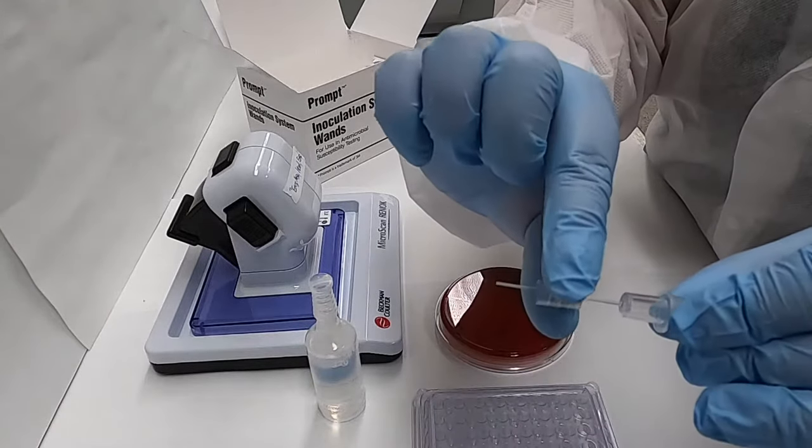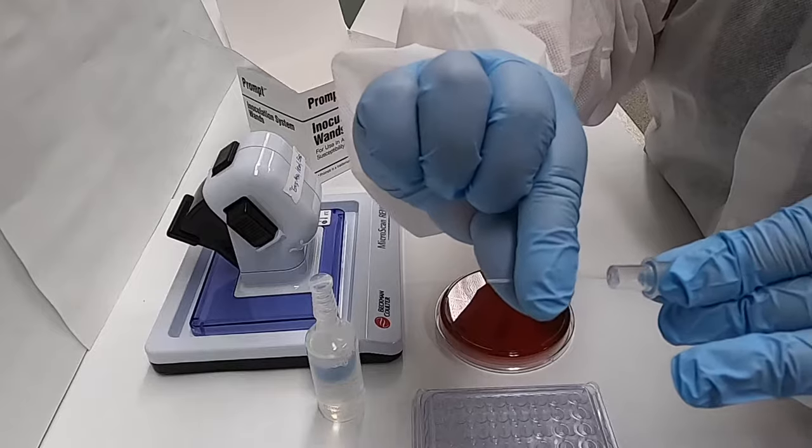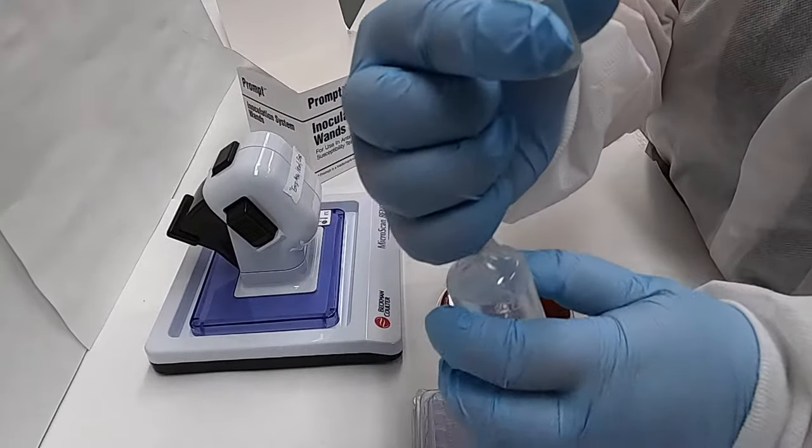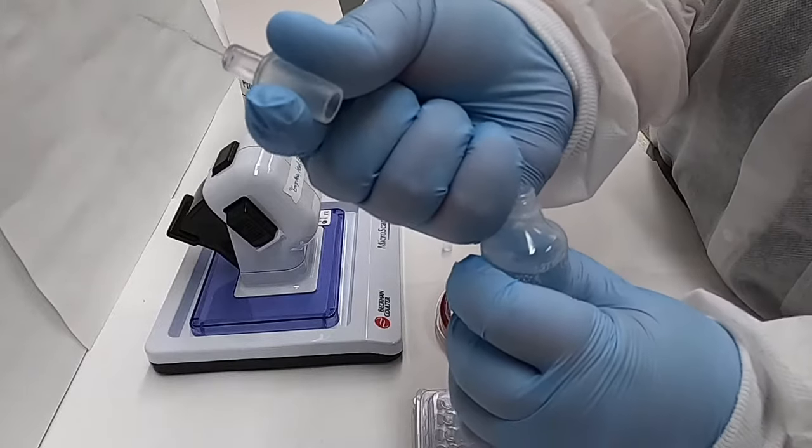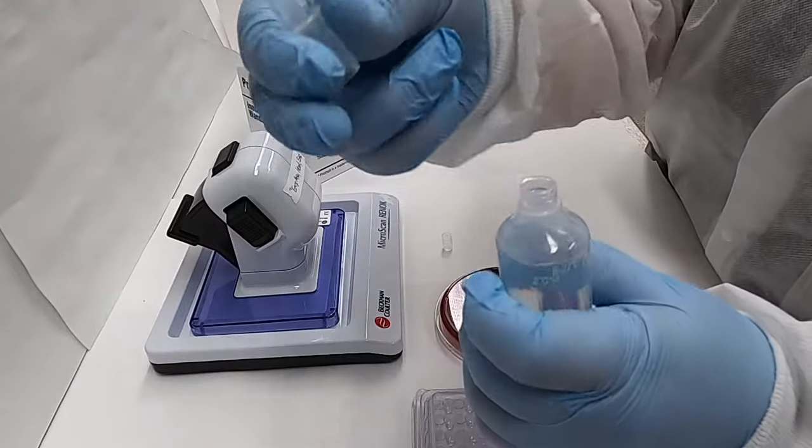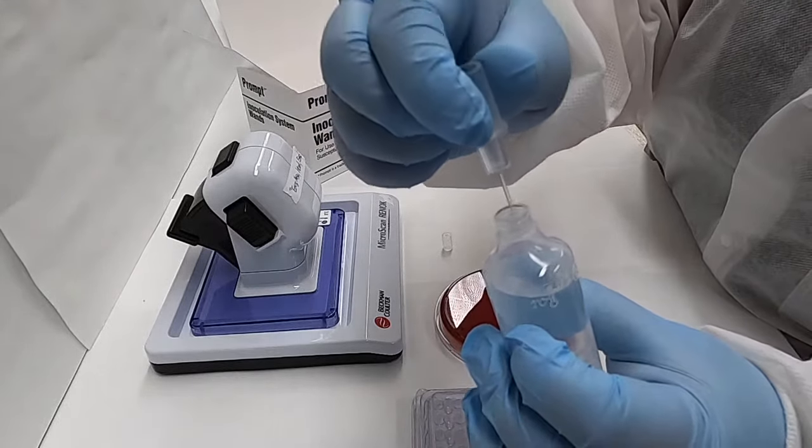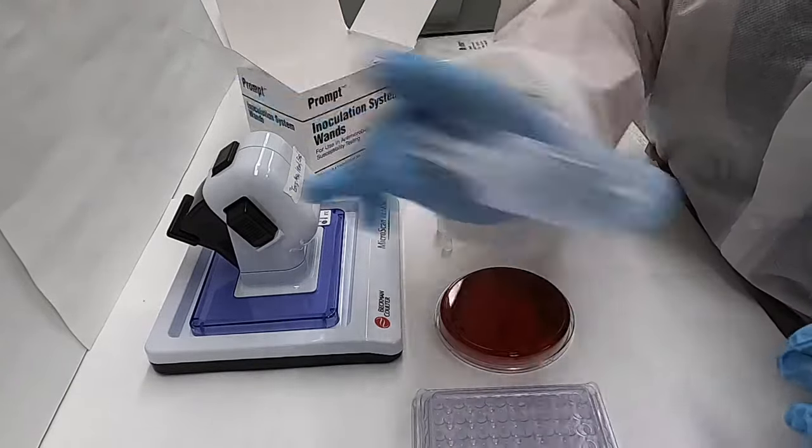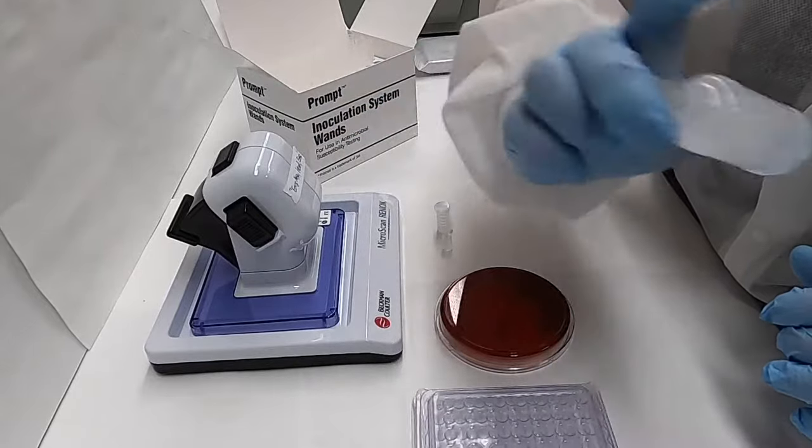We start by touching three colonies and then removing the wand collar in order to get rid of excess bacteria. The wand is then inoculated into the liquid culture media and that media is then shaken vigorously to ensure that the suspension is homogeneous.